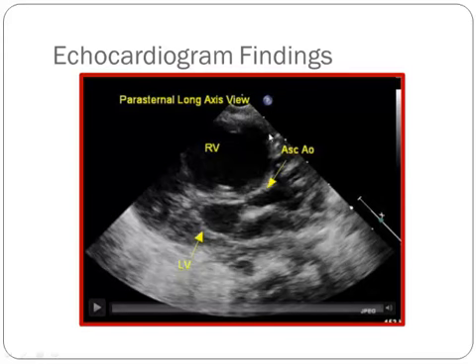So looking by echocardiogram, here we're looking at a parasternal long axis view, so you can see a large right ventricle, and here you're going to see a small left ventricle. You're going to see a mitral valve that doesn't move very much, and then here is your tiny little aortic valve. And here we see the hypoplastic ascending aorta. And truthfully, I'm going to tell you, this is actually one of the larger ascending aortas that I've seen. Ascending aortas measuring 2 to 3 millimeters in diameter are not uncommon in hypoplastic left heart syndrome.